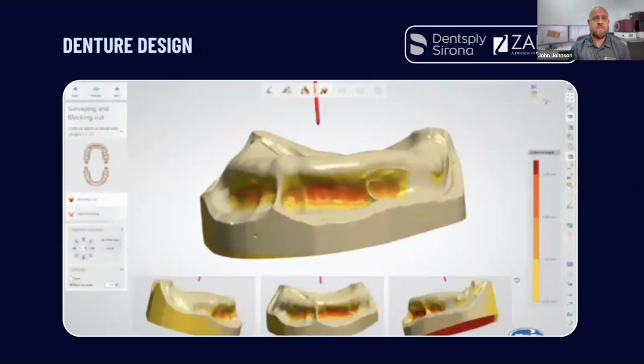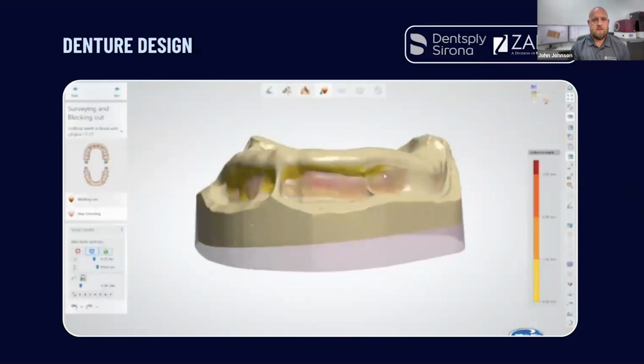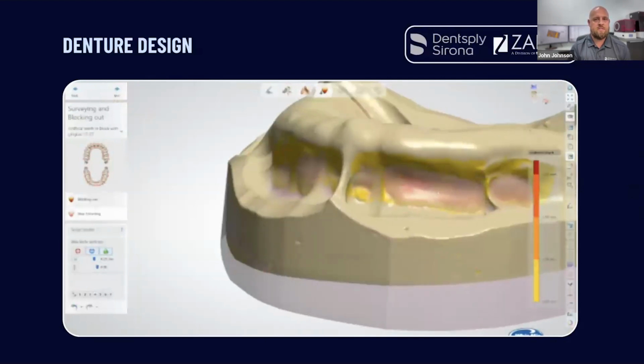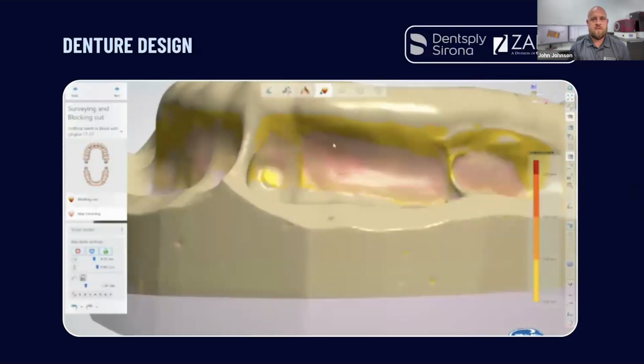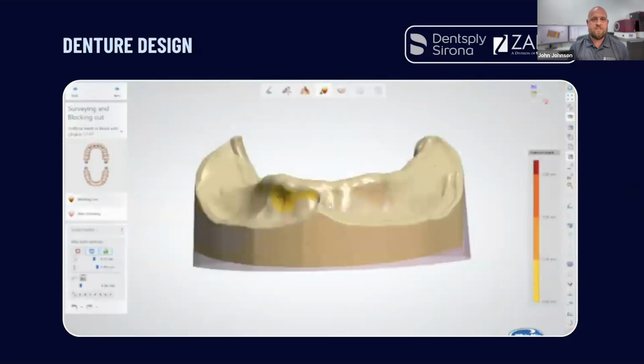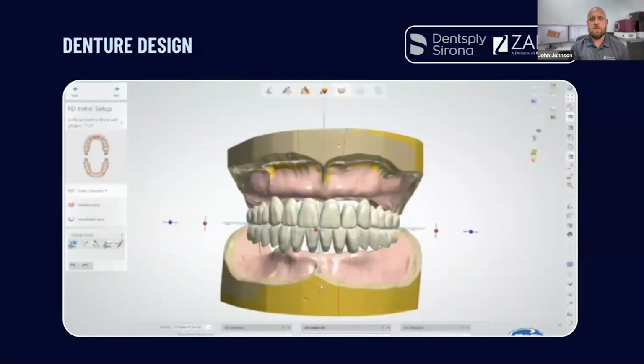Another really cool feature is the blockout feature. It's really nice because you can utilize the undercuts that you want to utilize, and you can block out some areas that may be a little bit too aggressive. So this really gives you essentially a surveyed denture. It gives you a lot of freedom there to produce something that you'd like.